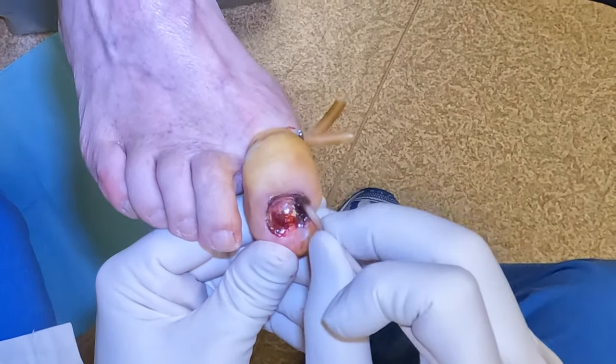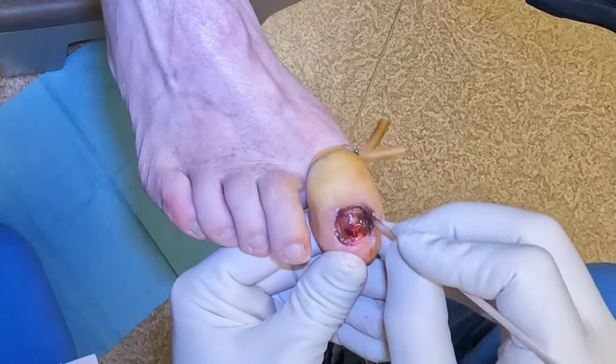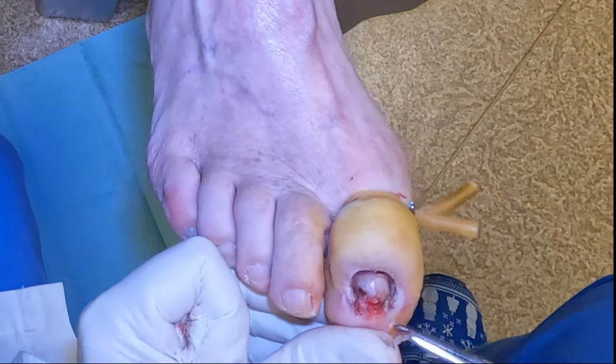We want to do our best to minimize getting the phenol on the healthy skin because it can create a burn. After we're done, all of that gets cleaned off and we remove any debris — and that's it, we're done.